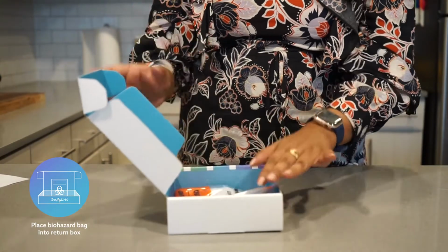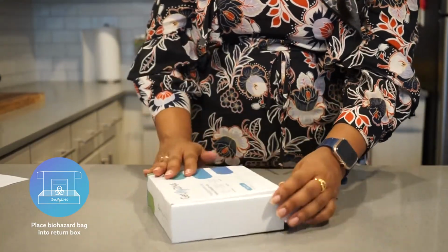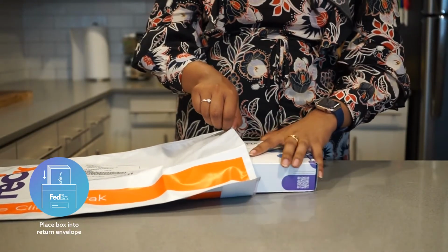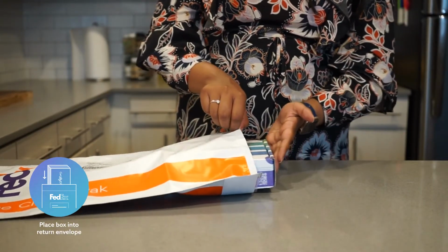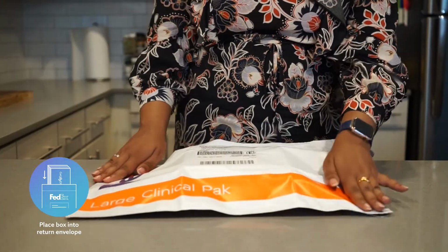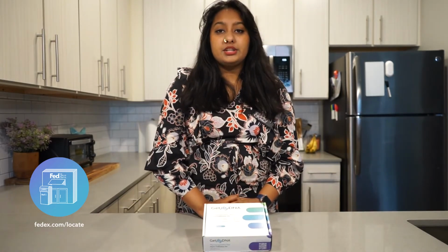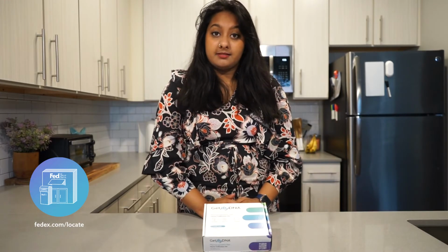After you successfully collected your sample, it's time to return them to the lab. Place the biohazard bag containing your 2 cheek swabs into the box your kit came in. Place the box with your samples into a pre-addressed and prepaid return envelope found in your kit and then securely close the envelope. Then find your nearest FedEx drop-off location. To find a FedEx drop-off location, go to fedex.com/locate. It is important to return your sample as soon as possible after collection.